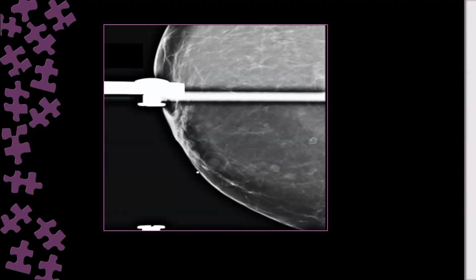I told you this is not exactly spot magnification. It is like spot magnification. It is something focalized, a view for a certain region of the breast. Which part of the breast does it demonstrate? Medial part of the breast.